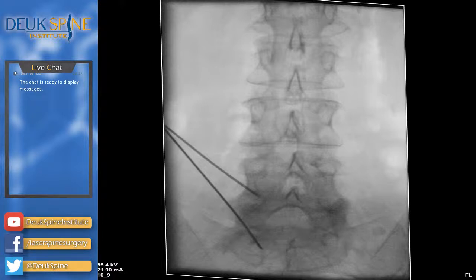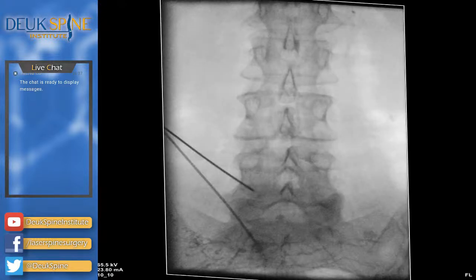How bad is that on a scale of 1 to 10? 10? Is that where you get your back pain? Isn't that amazing? There's like no disc left, 99% collapse. Just relax, you're fine. I apologize. You said it was a 10? Let's go to a lateral. Once again, the dye isn't even staying in the disc, it just leaks out.